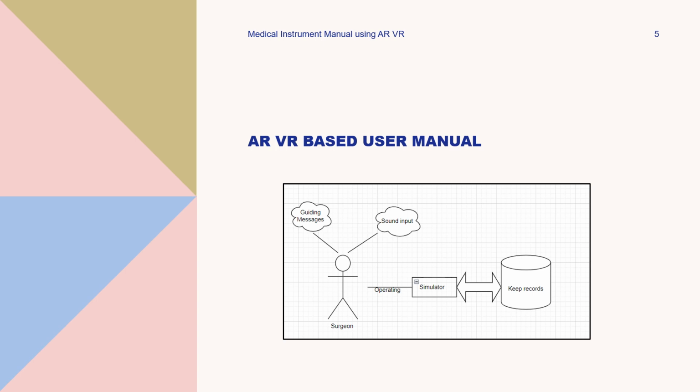augmented world actually, wherein we would be displaying guiding messages to the surgeon about what key needs to be pressed to perform the demo. Similarly, we will be guiding him through sound input as well, and we will be keeping a record of whatever response the surgeon gives into the system.